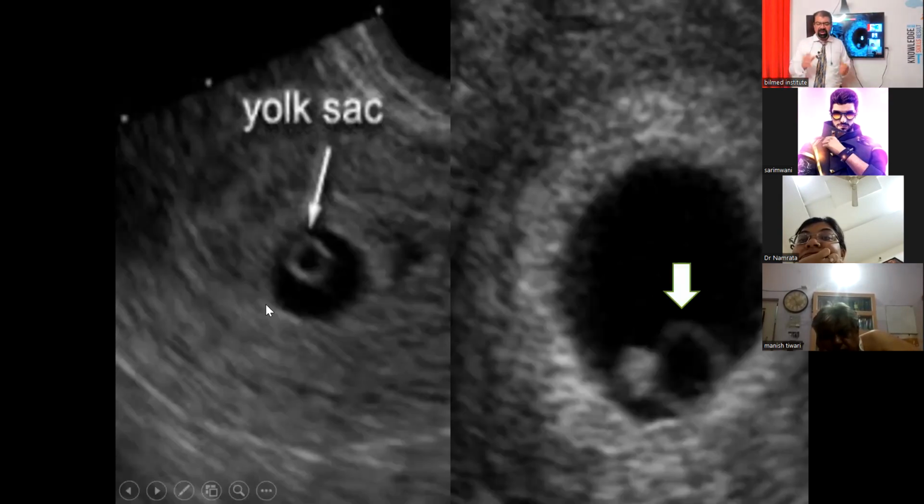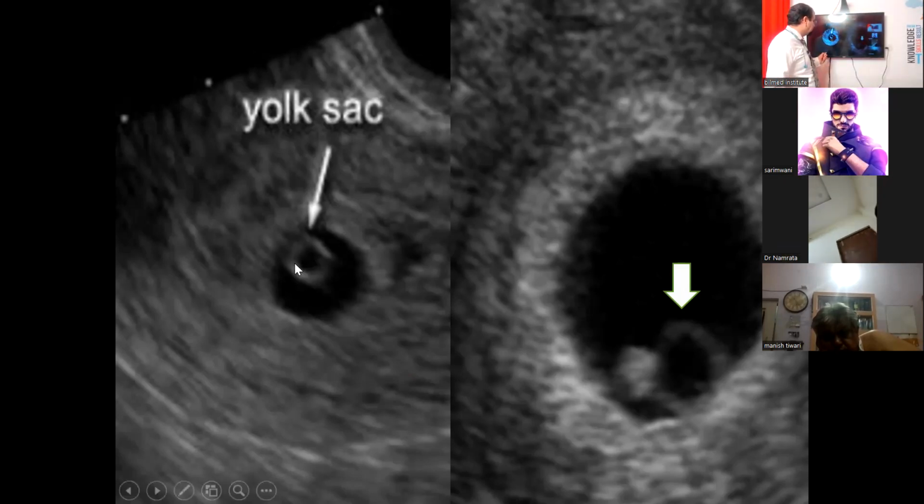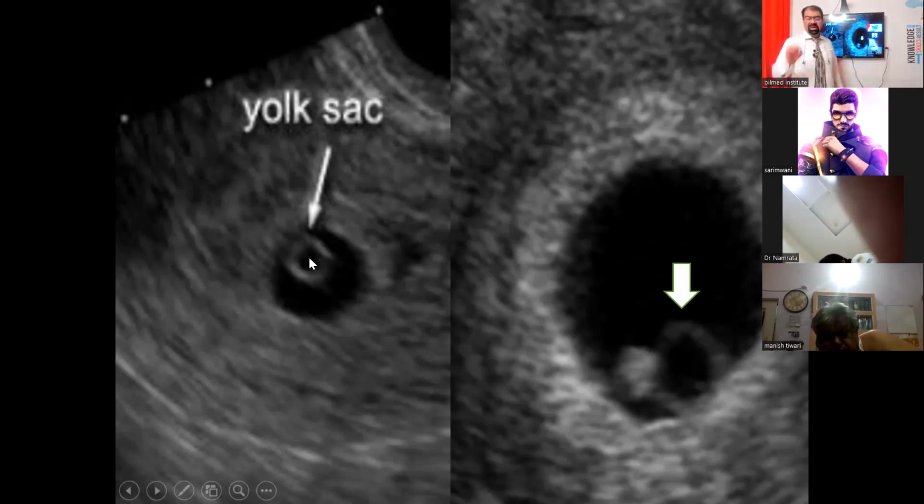It has to be round only, like this. And the inner circle, I mean the yolk sac center, has to be jet black only.